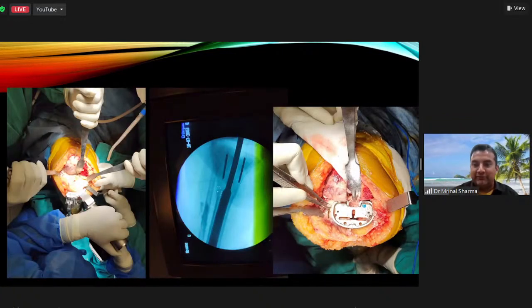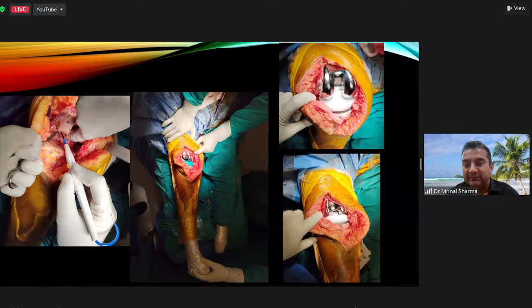After that, I removed that jig and could do my proximal tibial cut. This was an innovation I made on the table because I did not want to put in a plate and reduce the fracture, especially when it was an acute fracture that would have easily reduced. I checked with the C-arm that I was reaming in the correct direction, and planned a snug fitting tibial stem. I did all the lateral releases as proposed by the previous speakers. Ultimately, it was so stiff in valgus that I even had to release the popliteus.